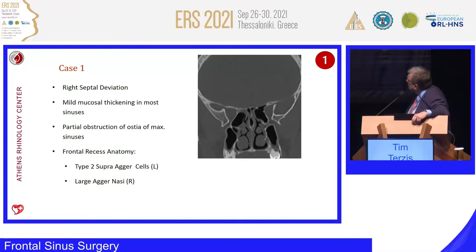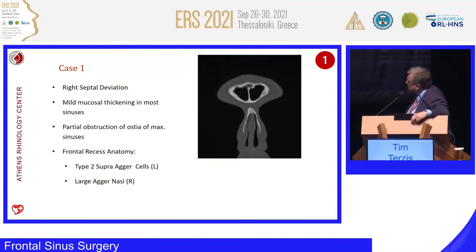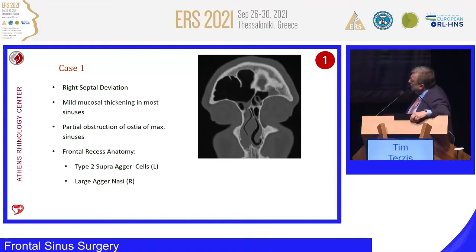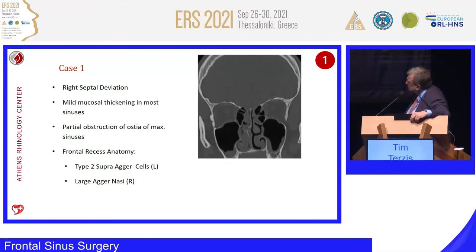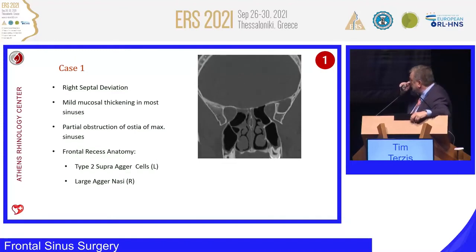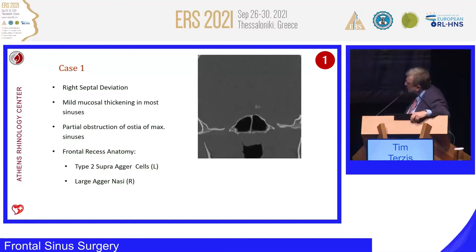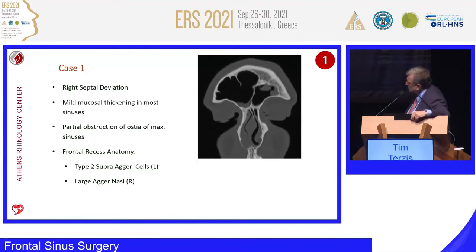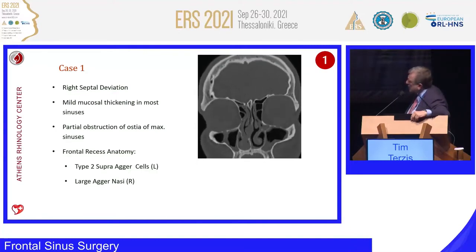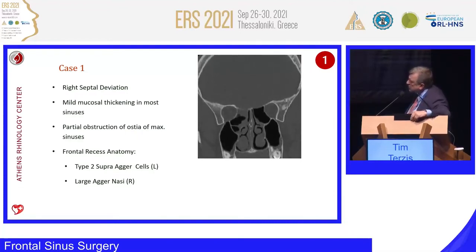And there's as well this septal spur. Maybe the septal spur is affecting and creating the pain as well, a contact headache point, maybe. So these are the options. Balloon in my hands, I wouldn't go for it because it's very complicated to go up and maybe to create more problem than benefit. And in case of surgery, I would do what I'm presenting here, the School of Graz. I would follow the anatomy and go up very gently. Absolutely, and that would be my option. Right, thanks very much. Phillipe, would you like to comment, please?